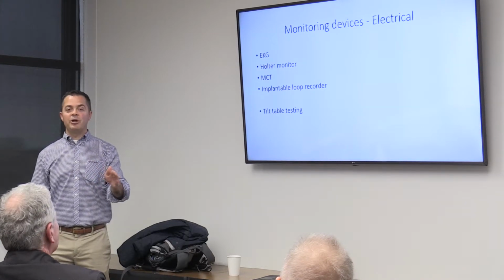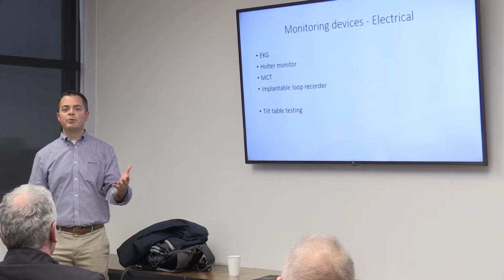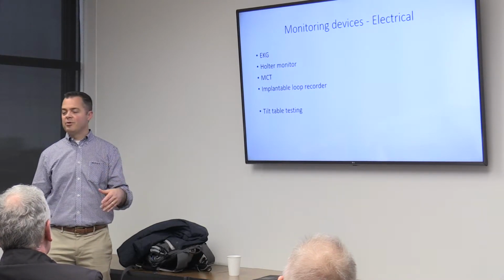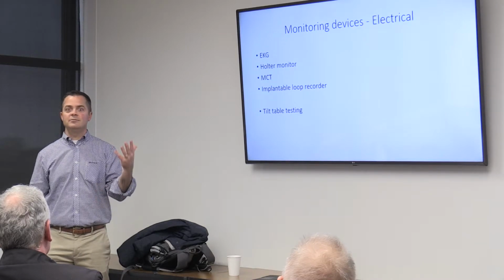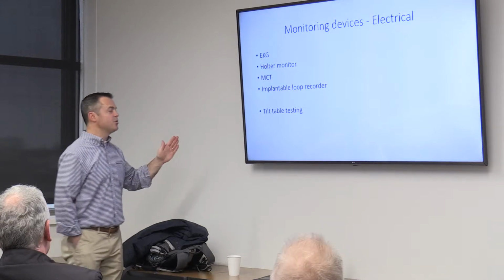So you've got to know who to order a Holter on. Primary care docs call me all the time. Well, he's been having palpitations. I already did a Holter. It's normal. Well, how frequent were the palpitations? Well, he has them like once every 6 weeks. I said, well, what are you going to do? I mean, you're not going to catch it. Unlikely. You can still try.